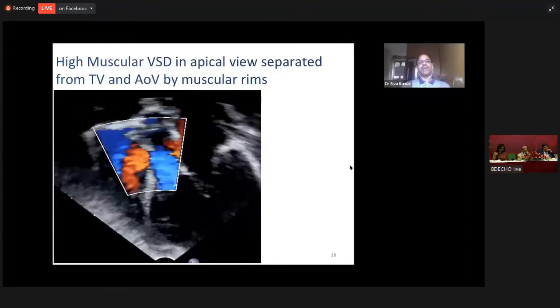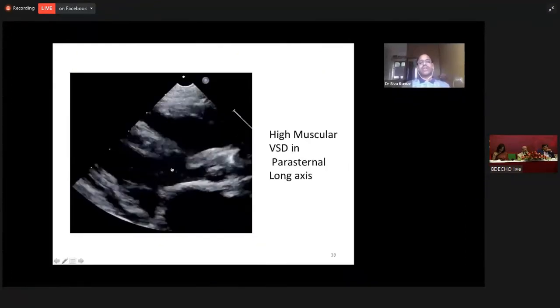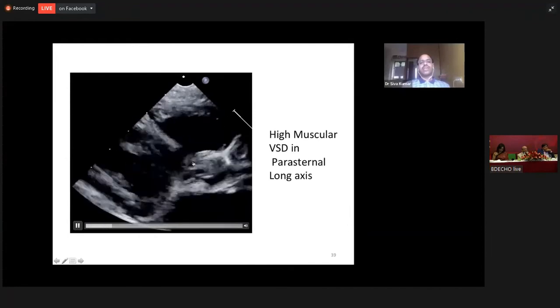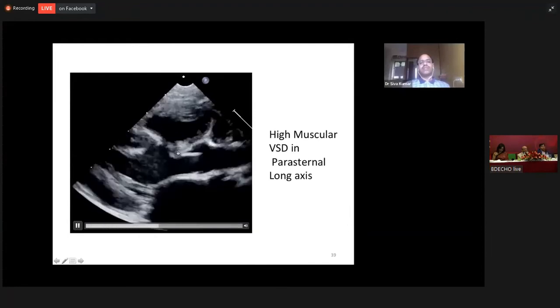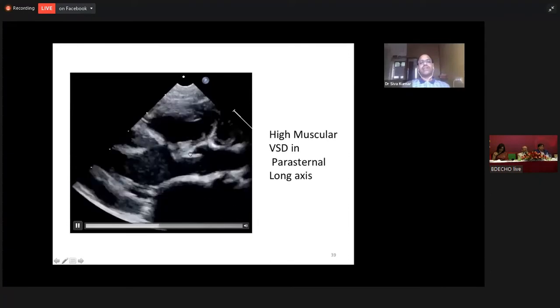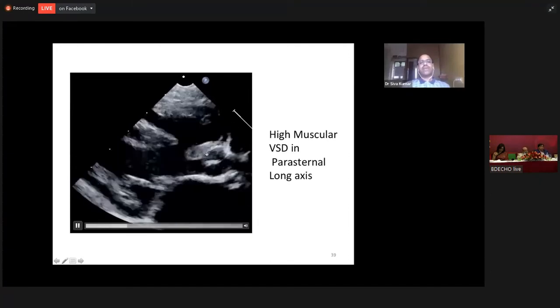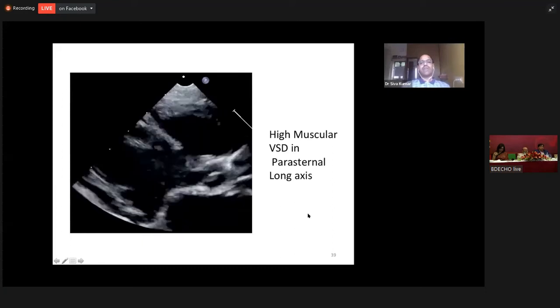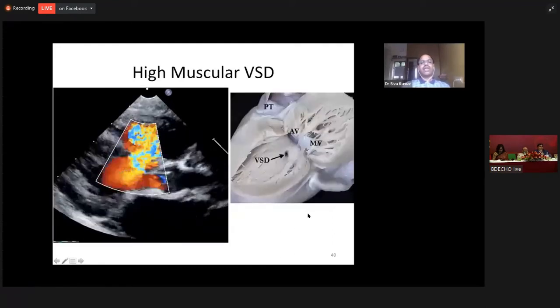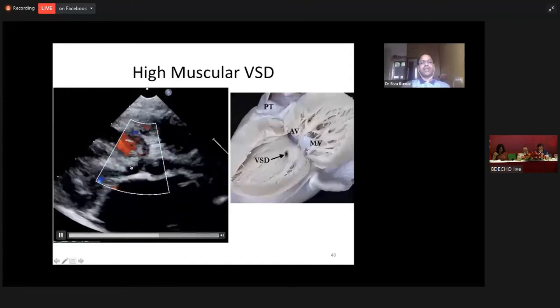These are ones that are amenable for device closure. When you look at it on a parasternal long axis view, you can see a good separation between the ventricular septal defect and the aortic valve by a long muscular septum. So this is a high muscular or basal muscular VSD, which is also seen well on a color flow here on a parasternal long axis view.